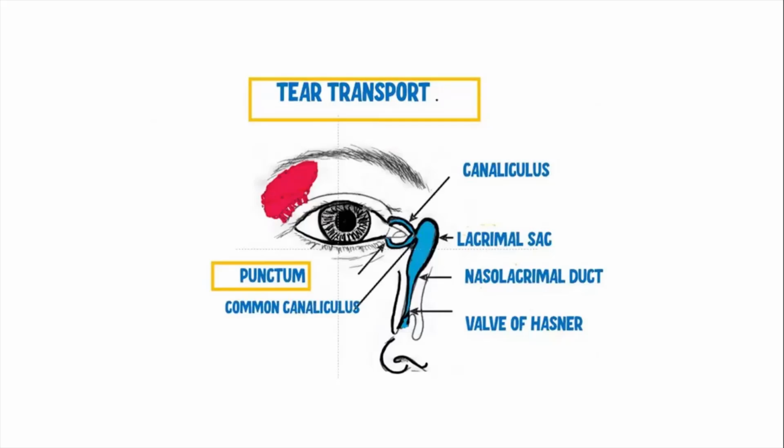This is a basic view of the canaliculus, the upper and lower canaliculus, nasolacrimal duct, and all that. If you visualize endonasally, you can see the inferior turbinate and inferior meatus, where you can see straight away the nasolacrimal duct opens. Most of the time in infected cases, you can see the pus point draining in the inferior meatus. So diagnostic nasal endoscopy is the first gold standard before embarking on endo DCRs.